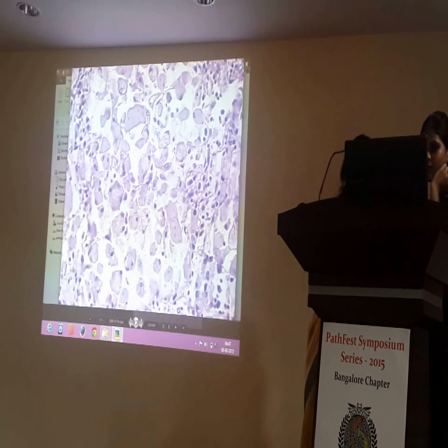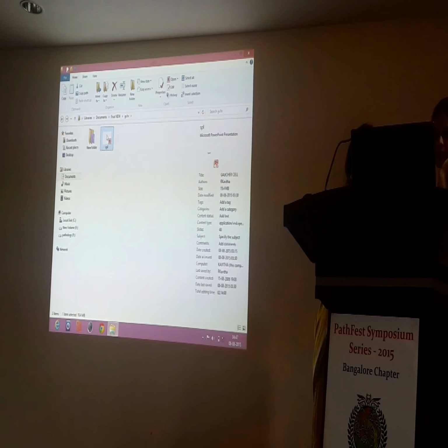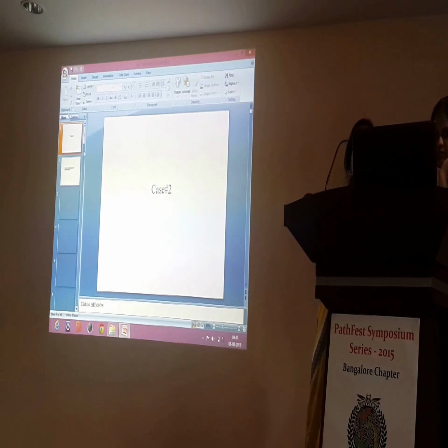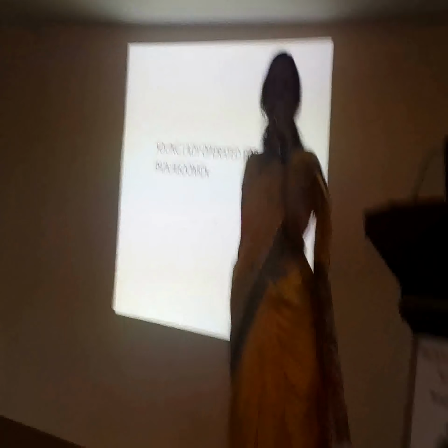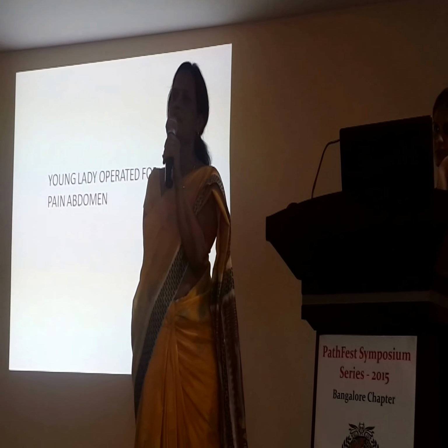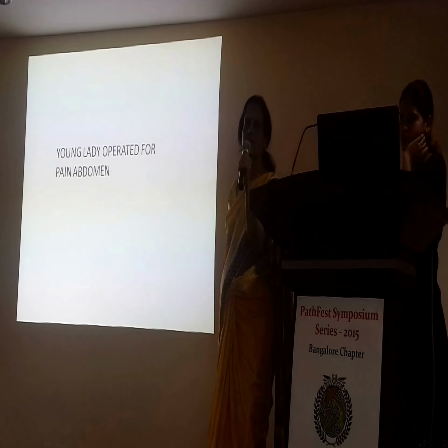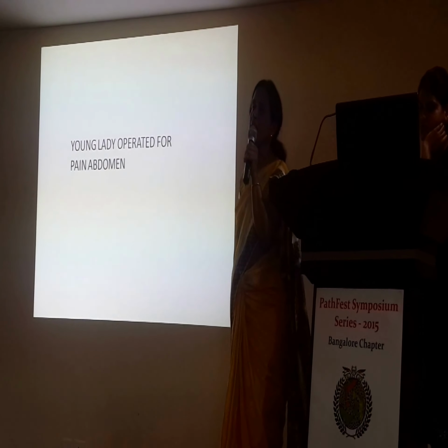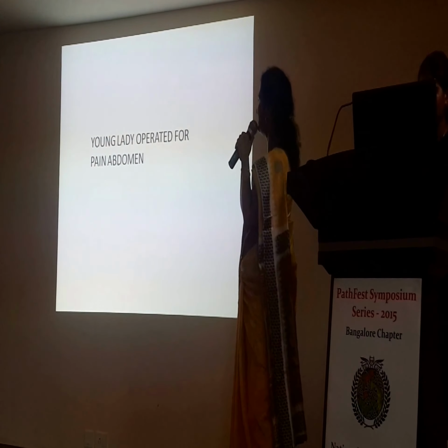Yeah, we'll go to the PPT first, and then come back here. One or two pictures in the PPT. This was a young lady who underwent laparotomy, and the specimen was sent to us. This is the history I've given. Nothing else. So if you want to ask any other history, now I'll give you. Next.